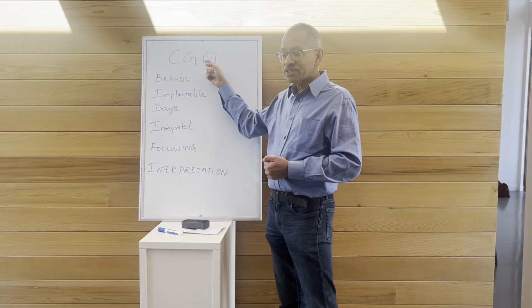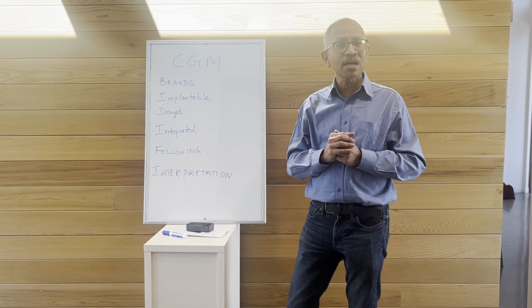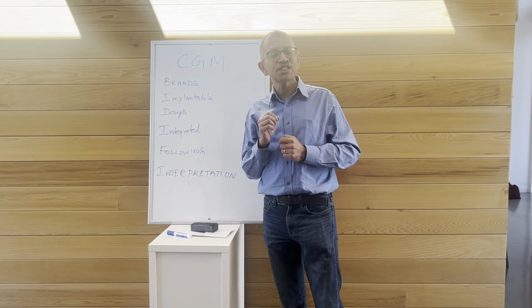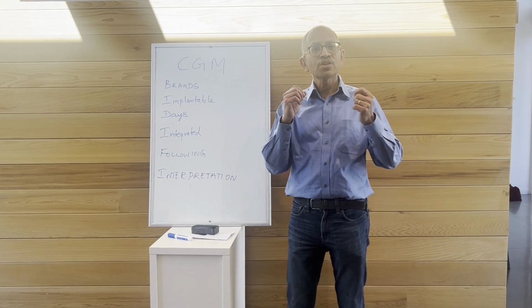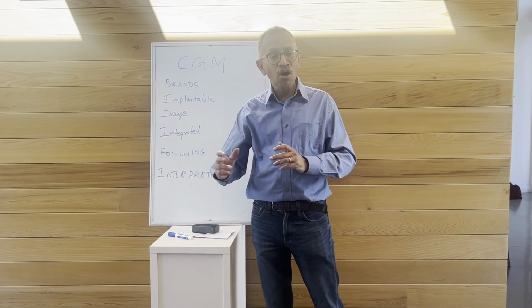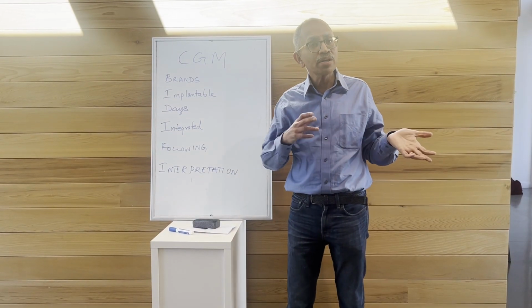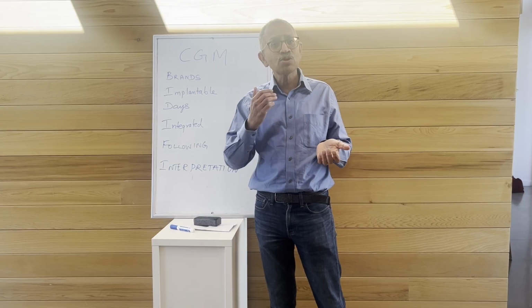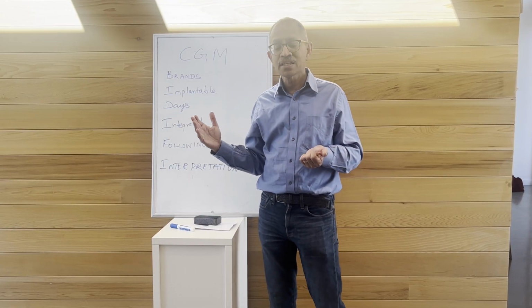So the data from CGM can go into the pump to help you analyze how much of insulin to be given. But the most important thing of CGM is to give you the ability to follow the patient you are following, either be your child or an important family member, or it could be your patient from a remote location. So you can have the data seen on a consistent basis.